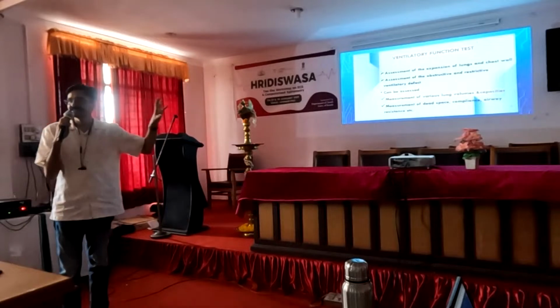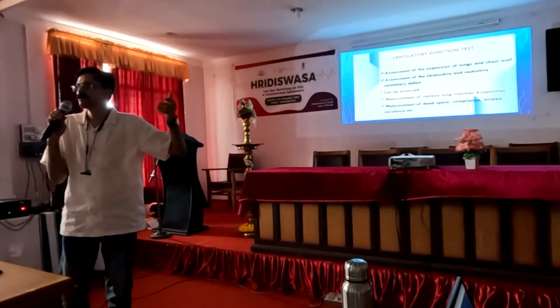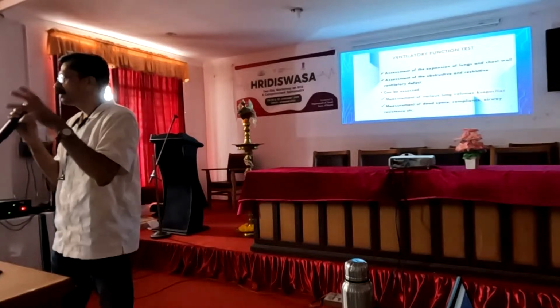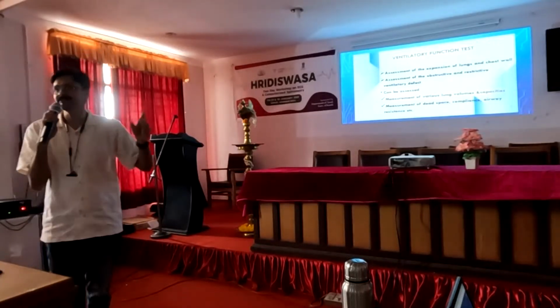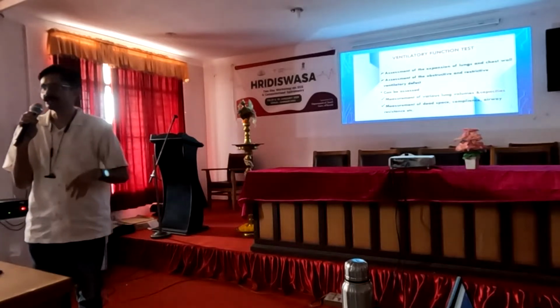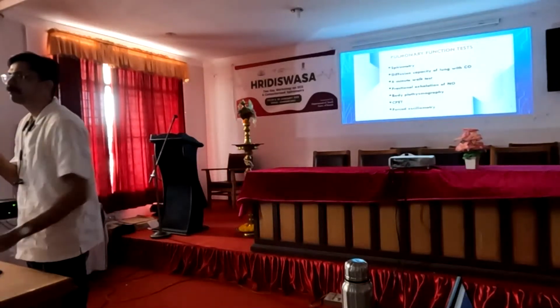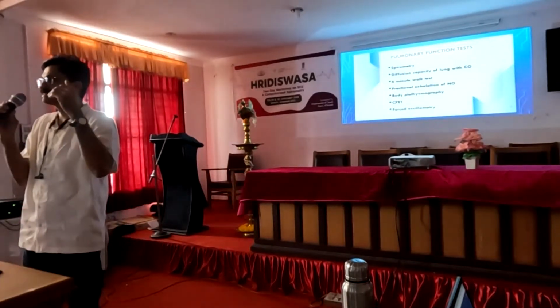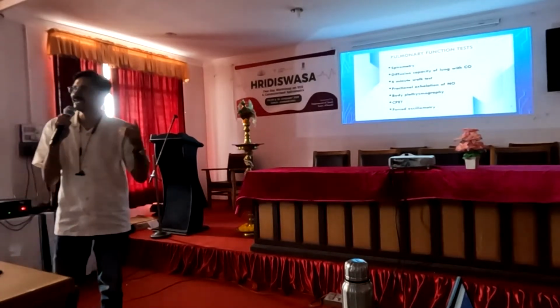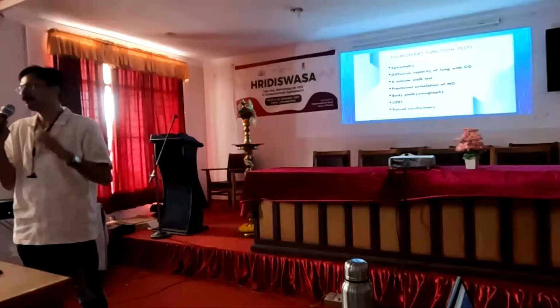The major portion we are going to deal with is the measurement of lung volumes and capacities. Mainly, the pulmonary function test assesses the physiological status of the lungs, the function of the lungs and the airways.